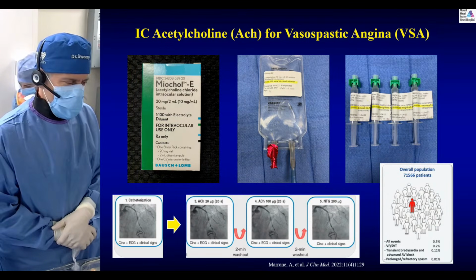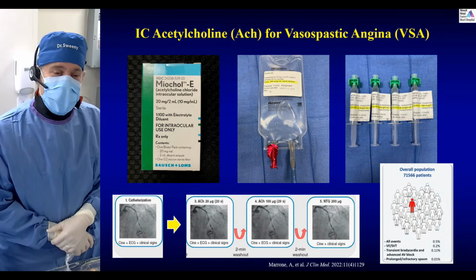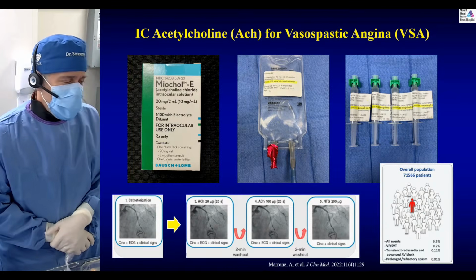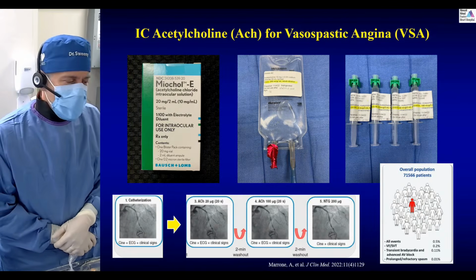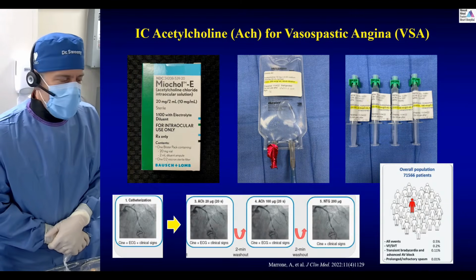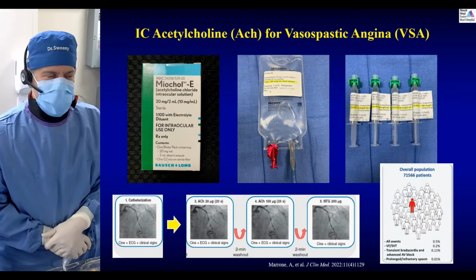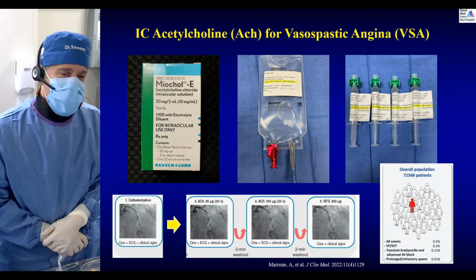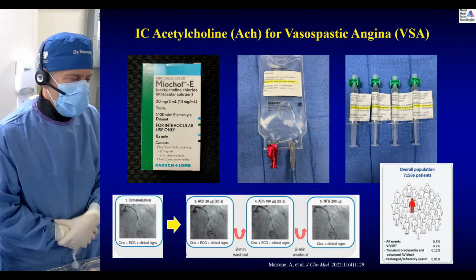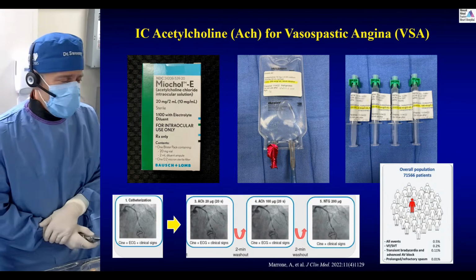This is what a lot of people don't understand: it's actually a very safe procedure. There's one trial that looked at over 71,000 patients. The overall risk of adverse events in this is less than 1%, and persistent vasospasm is very, very low, less than 0.1%. So it's a very safe procedure if it's done with the right methodical procedural approach that we try to teach here, and a lot of centers do it in the country.